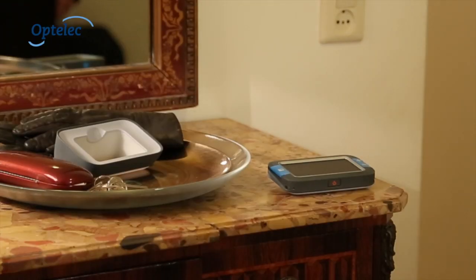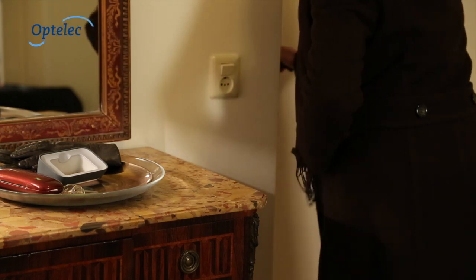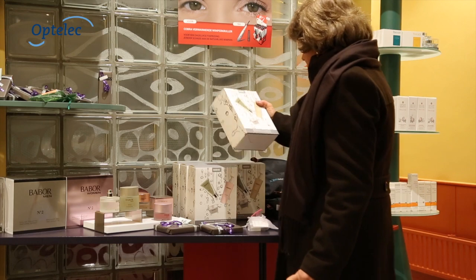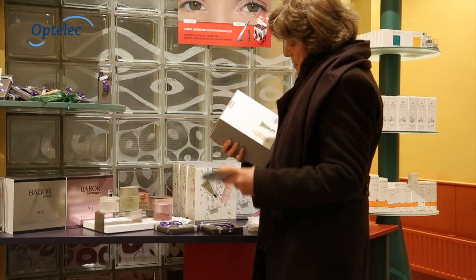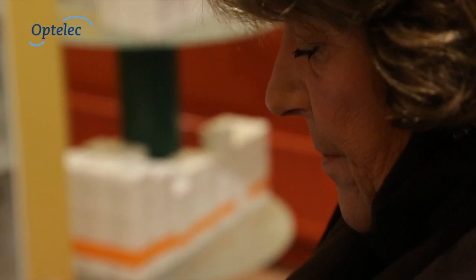When not used with the stand, it offers more portability as a compact video magnifier that conveniently fits in a pocket or purse. This makes the Compact 4HD the smallest HD video magnifier available, and it's easy to use when on the go.